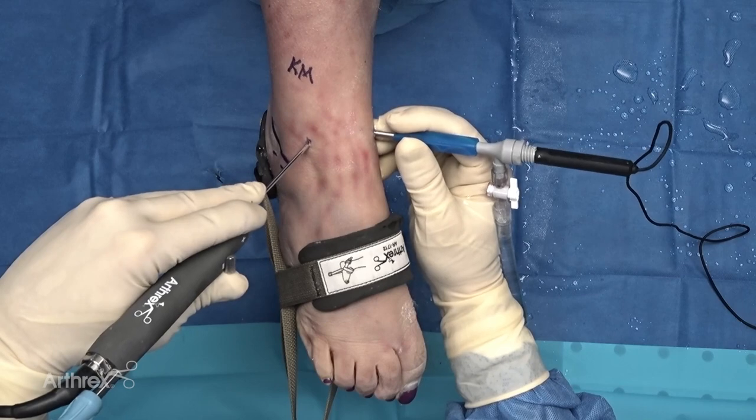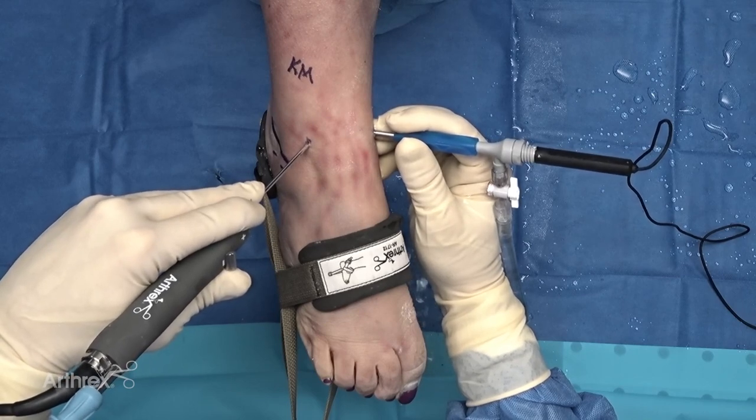Once you're inside the joint, the shaver can come in very small. This is the new Sabre shaver, and what's nice is how small it is — I'm able to negotiate inside the joint with very minimal friction and minimal distraction, yet able to move around freely. The shaver has good control; it's small yet aggressive, which is really what we're looking for.